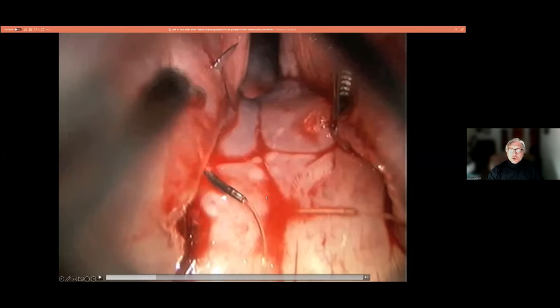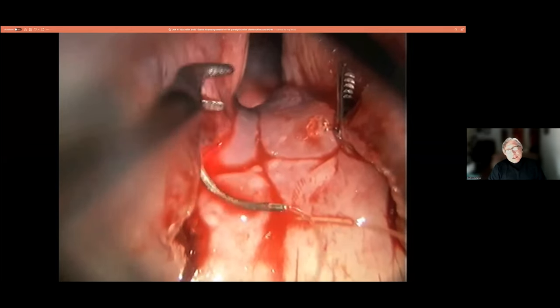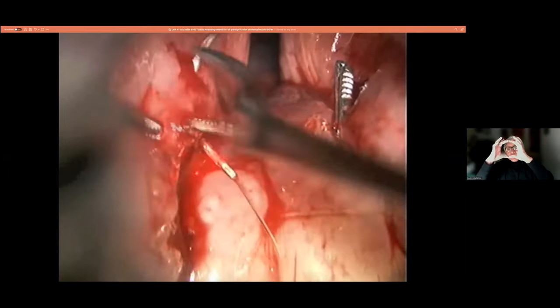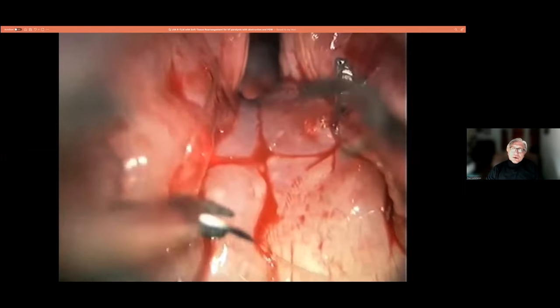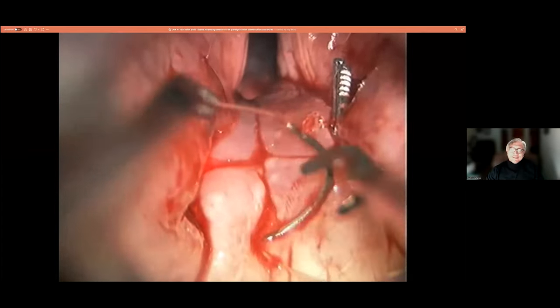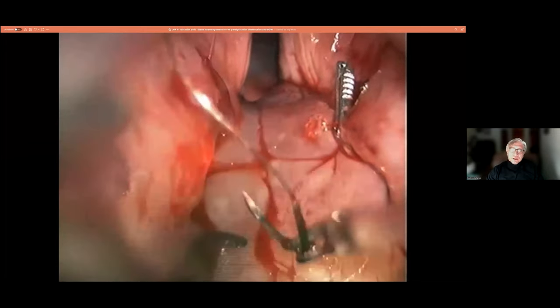So this suture now has been passed through the flap and then passed anteriorly and is now being drawn into the wound again. I almost always do double passes to get twice the amount of tissue brought together with half the tension. That's a pulley concept, and it's a tried and true concept in engineering. And by the way, we are soft tissue engineers. We're even soft tissue physicists sometimes as we try to figure out what's the matter with an airway.